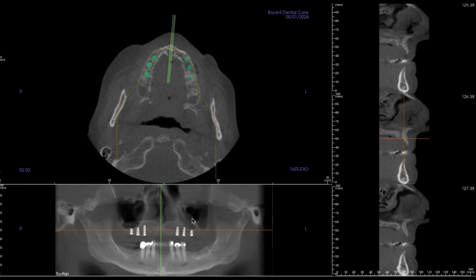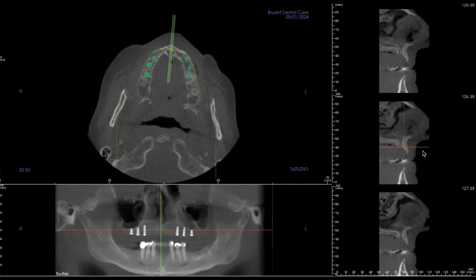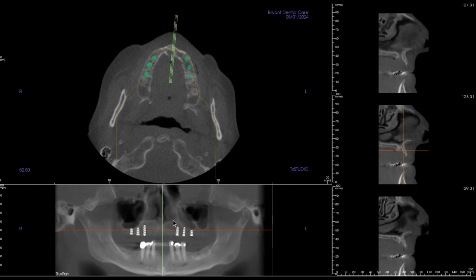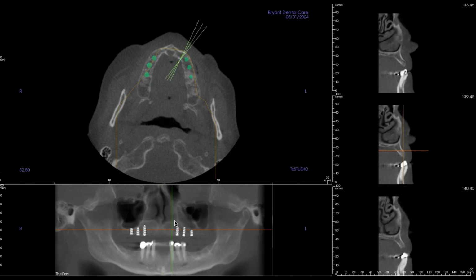Just to show you what's in the anterior so that you don't think we're missing an opportunity to place some anterior implants. You can take a look right here. Just not good bone in the anterior. And as we go more posterior, it gets better as far as its thickness, but the axial inclination is rather severe. She looks like she might have been class 3, which gives us the inability to place the implants anteriorly.